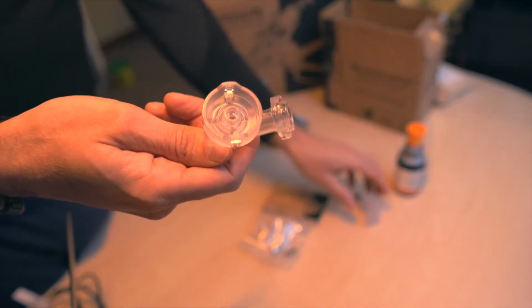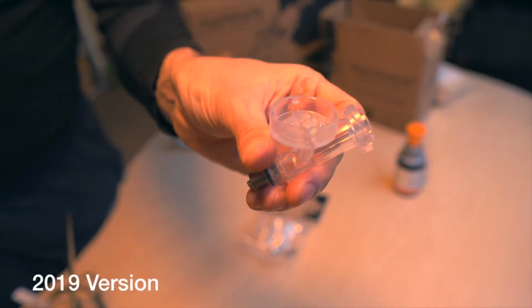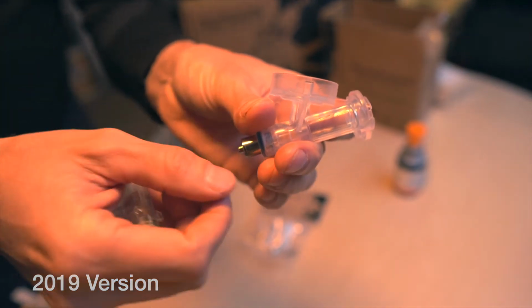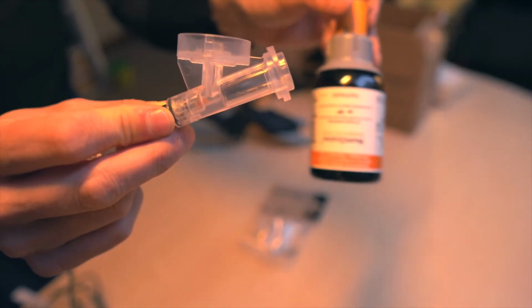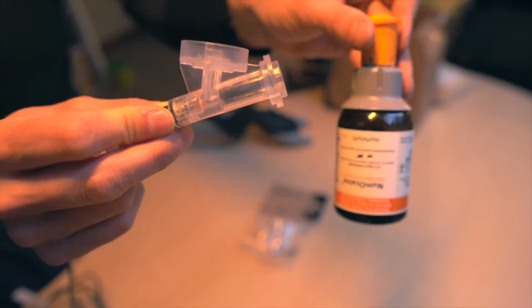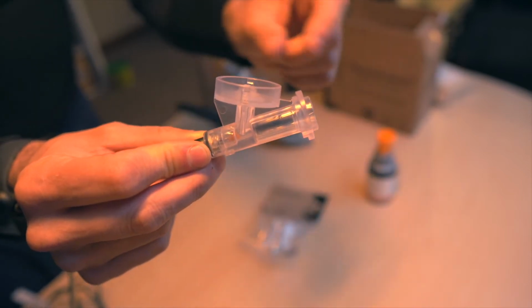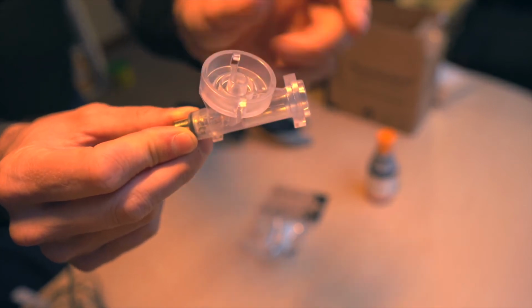Over the years, we've gradually improved this part. To begin with, in 2019, and there are probably very few of these left in circulation, the fluid junction had a flat top across here. This was because we thought that we were going to be packaging the Nummucaine in plastic bottles. Unfortunately, due to regulation, they had to come in glass bottles, which added over 100 grams to the weight of the device. This put extra strain on these small plastic lugs, and we had some cracking appearing in this part.